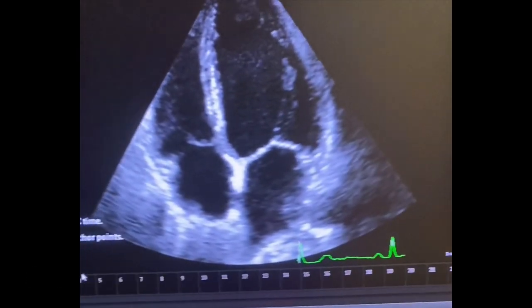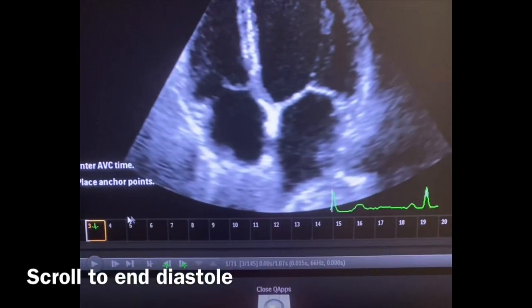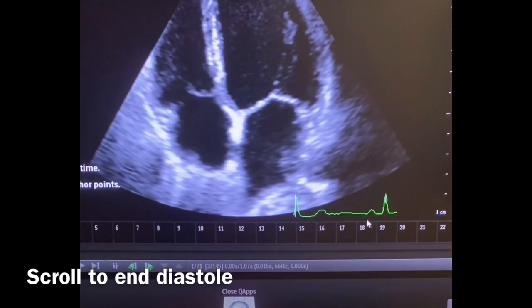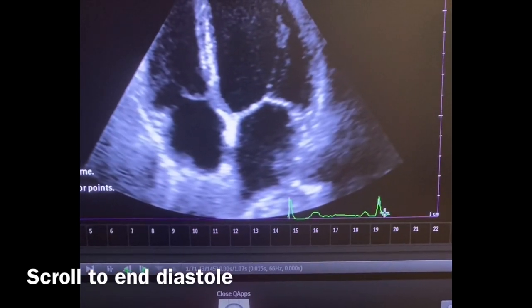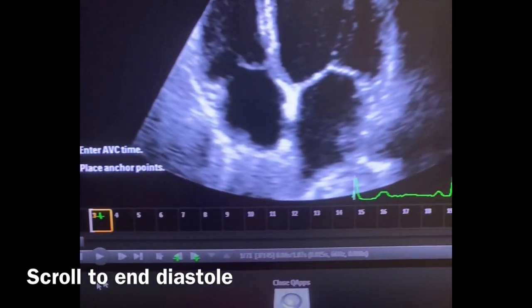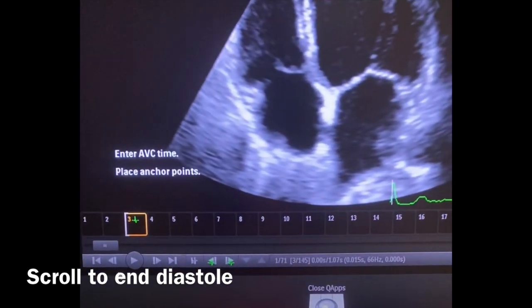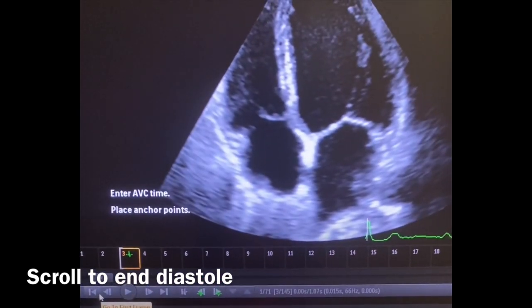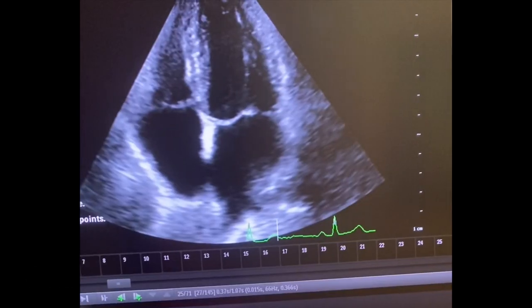Then you're going to come over here. As you know, there's an APG here. At the bottom, you're going to scroll back and hit play.